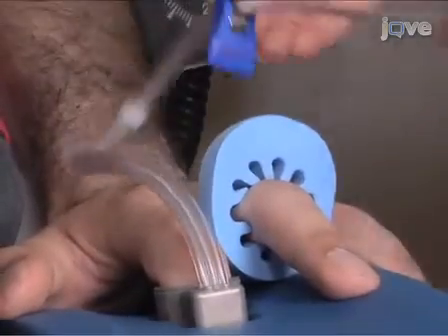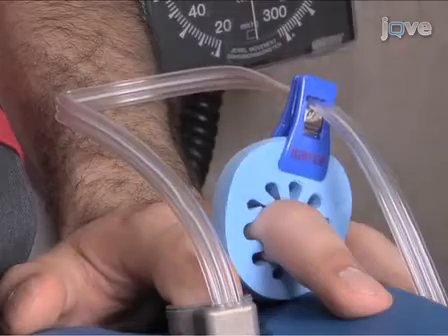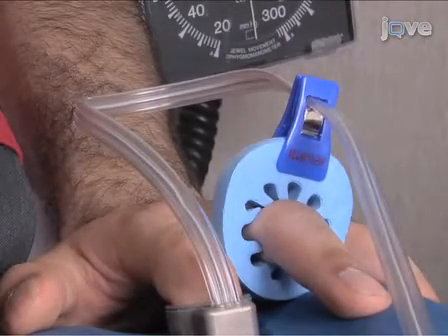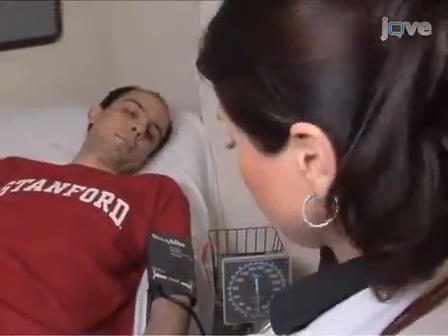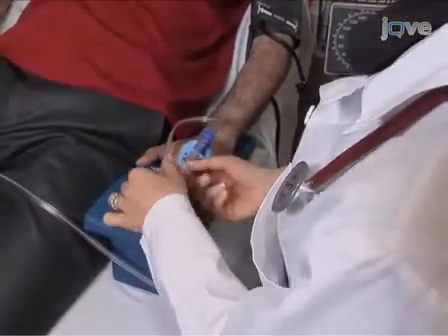Create a 7 to 10 centimeter loop with the pneumoelectrical tubing. This loop should extend from the PAT probe and return to the foam ring on the adjacent finger, with the rest of the tubing pointing out from the middle finger. Then, anchor the tubing to the foam ring with the attached clip and gently tape the tubing to the tip of the finger.